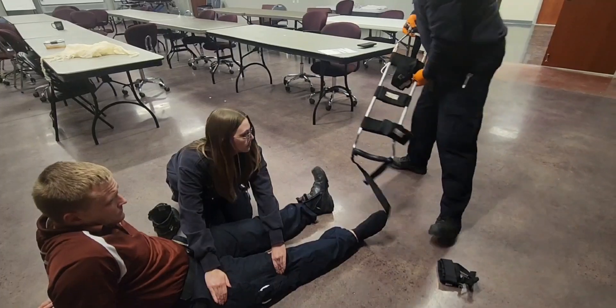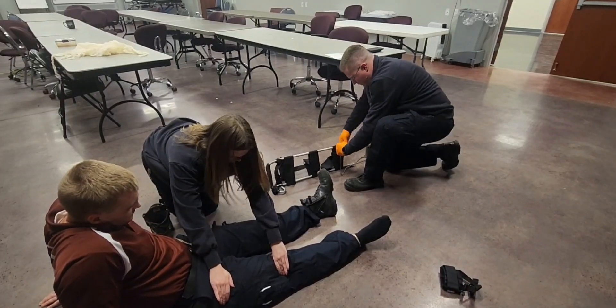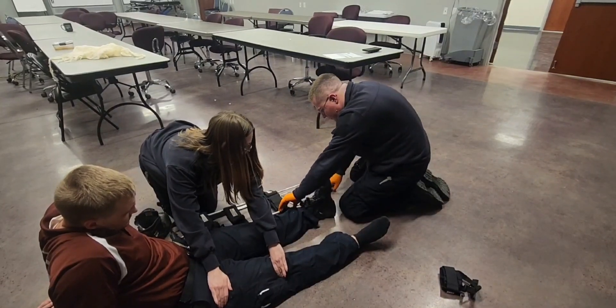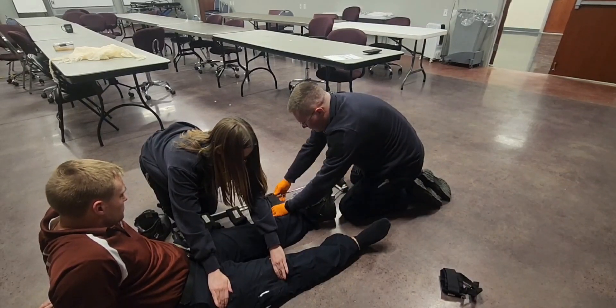I'm going to take the splint and measure it against the good leg, since we expect the injured leg to be a little bit shorter. That seems to be a decent length. We'll secure this splint.